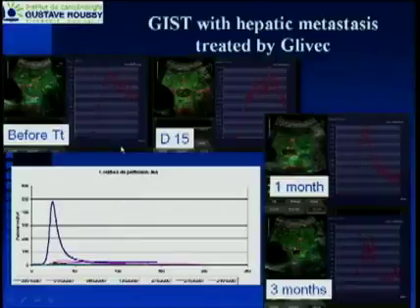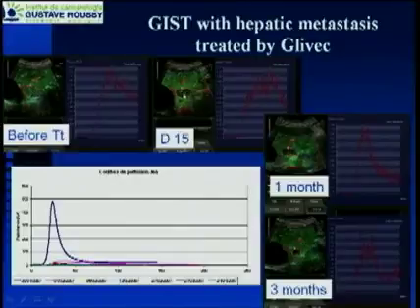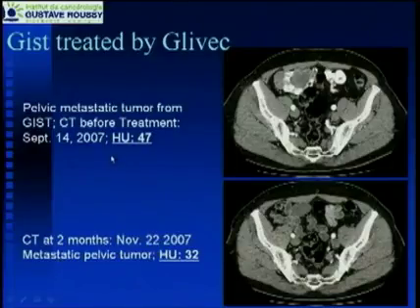We are moving to the GIST. This is a patient with metastasis in the liver, so before treatment, 2 weeks, 1 month, and 3 months, and the quantification. Another very interesting patient.